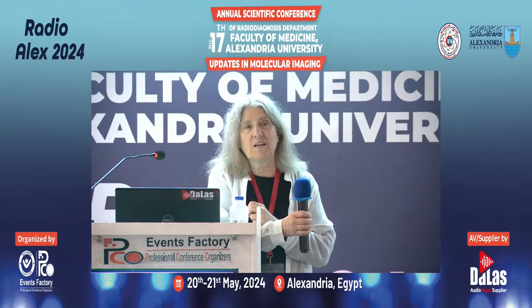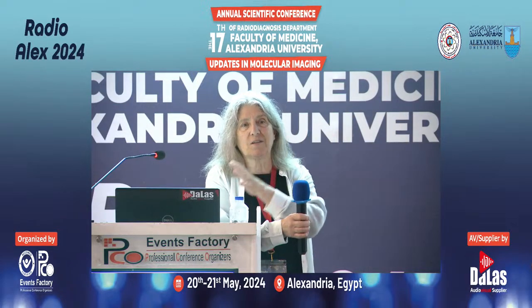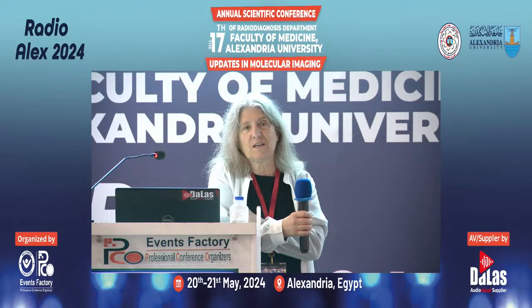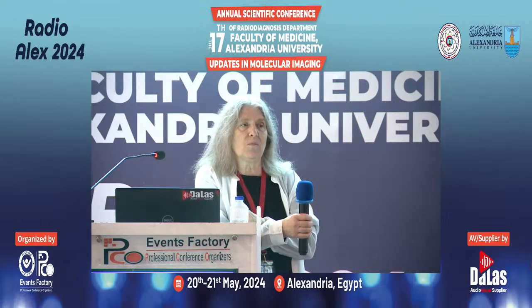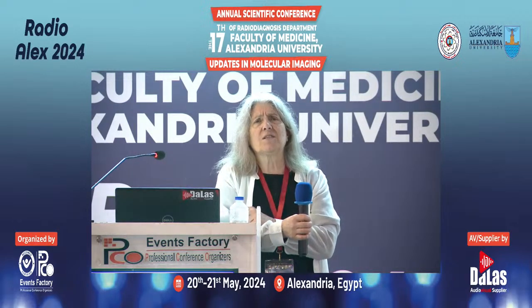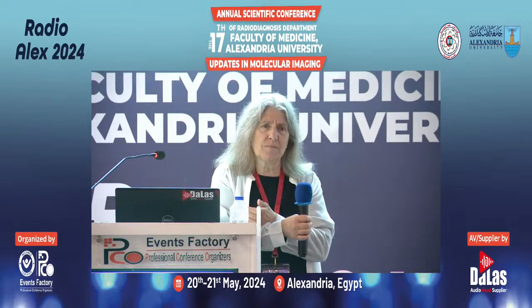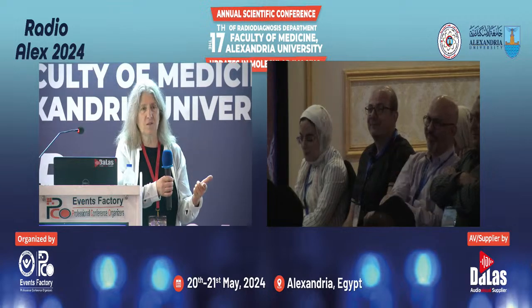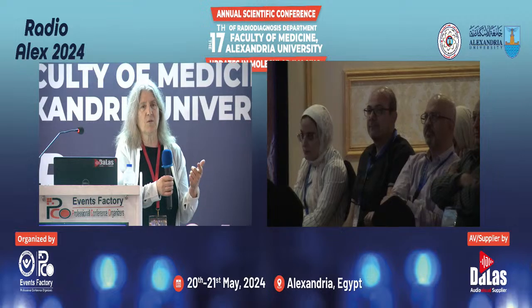You get excretion that's pretty constant throughout the entire interval. So I don't know if there's a good strategy for reducing urine activity with FDG. I really like the Posluma tracer that I showed you, which has reduced urine activity. I think that's going to be very helpful. The urine activity is the biggest problem with bladder cancer and also with recurrence. And there's no information on whether bladder cancer can be imaged with Posluma. I don't know that. But Posluma, the radiohybrid PSMA agent, the new agent, definitely has some advantages with low bladder activity.